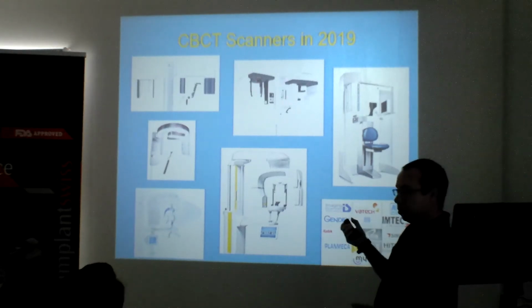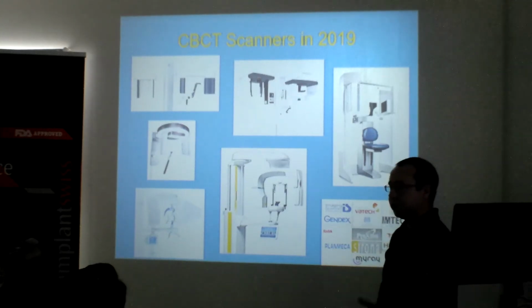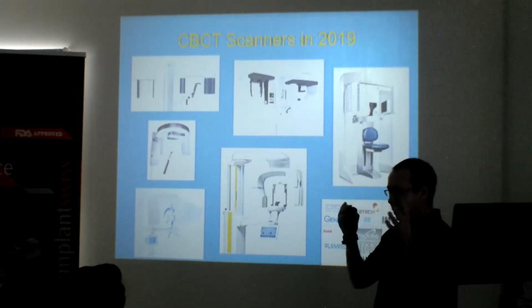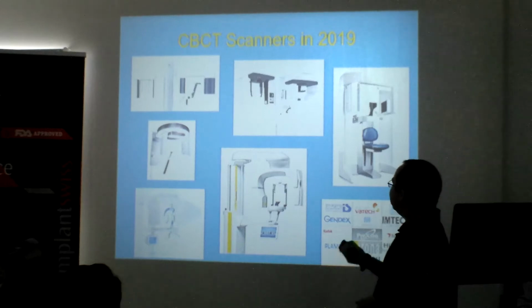We've got one of these in our Colchester centre. So this is a relatively newer scanner, and it has the ability to actually do large field scans. But it does 2 separate rotations around the patient. And there's a device with it that I kind of liken to something from Silence of the Lambs. It's got this big structure and the patient has to put their head in it and they're completely strapped in. We haven't used it yet, but it's quite daunting to look at.